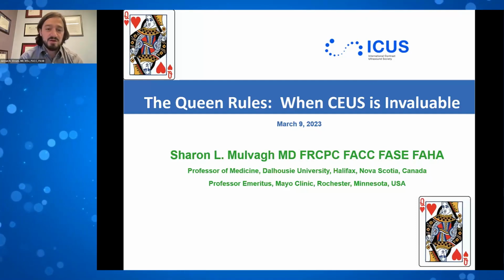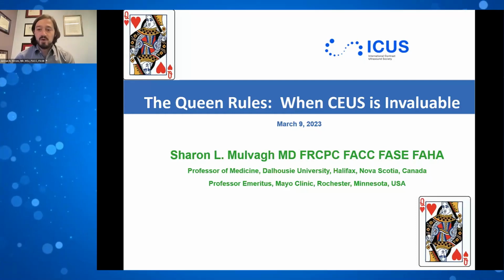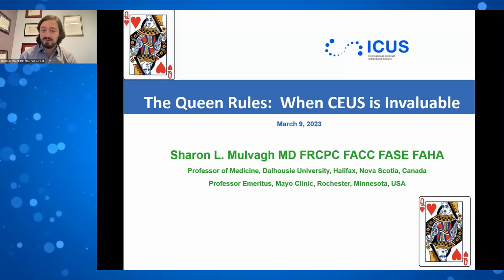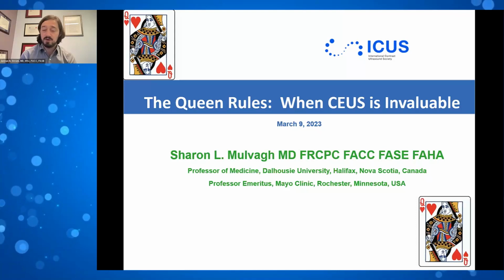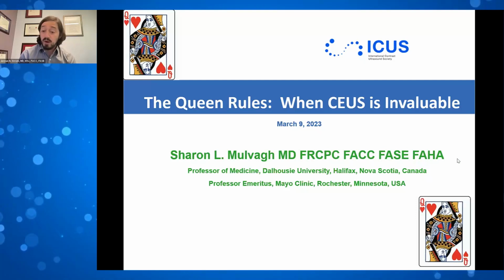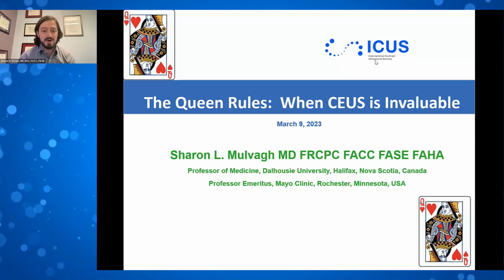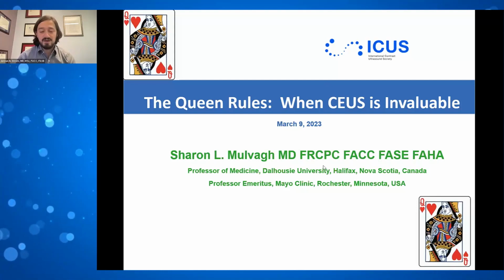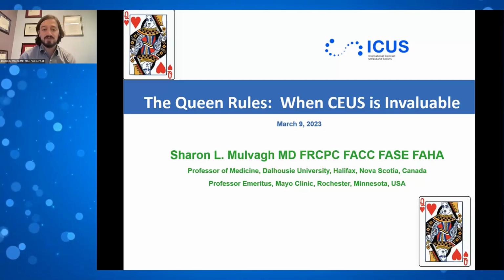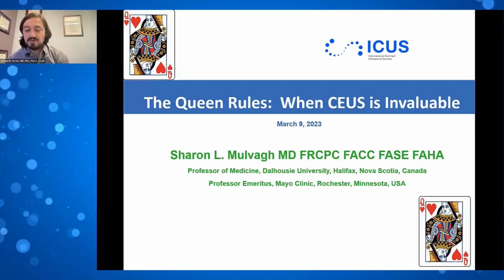And in terms of the explanation to inform patients, we try not to address this as contrast. We say this is part of a routine examination that helps us better understand and delineate the cardiac borders. What it does is it helps our decision making and helps us better understand and see pathology when it's present. And I think if you take that kind of tack or angle towards it, then we have not seen a lot of resistance to use of this, and it helps to level set with the patients ahead of time.